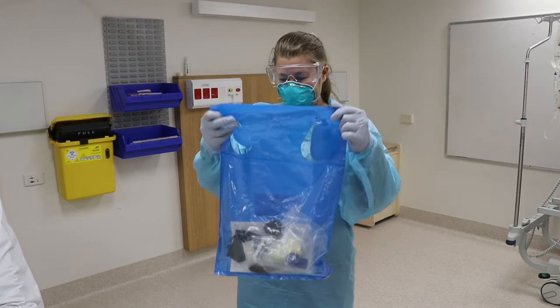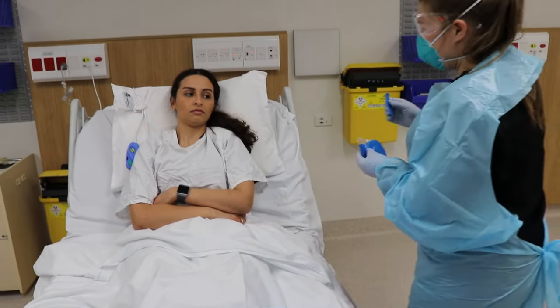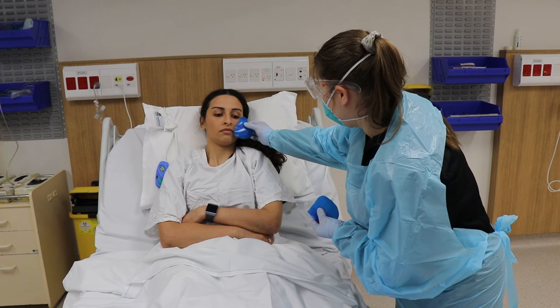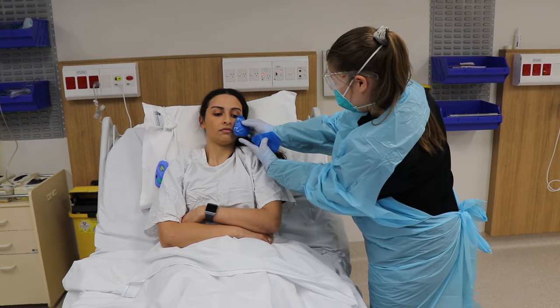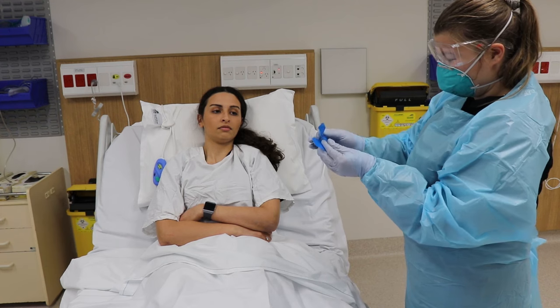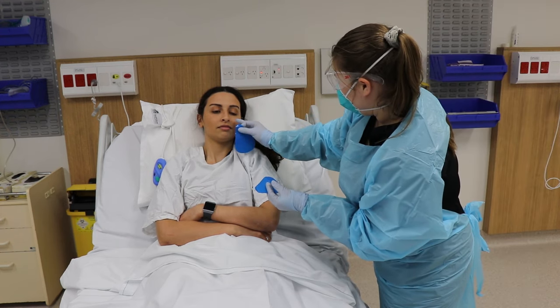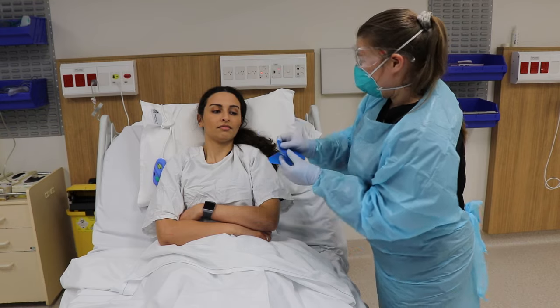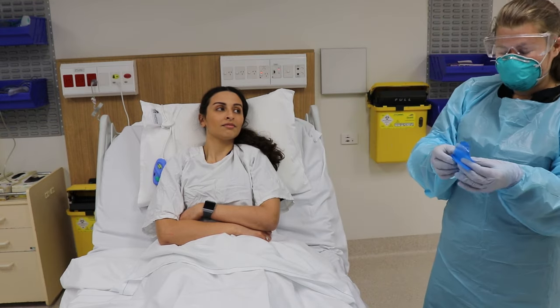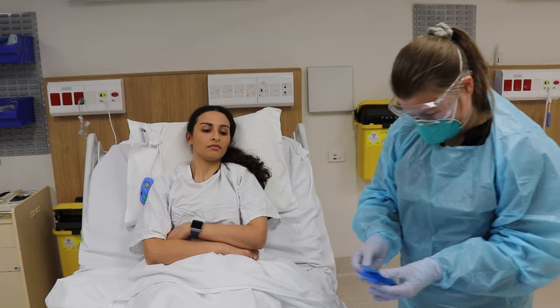Using the size guides, the bottom of the mask should fit under the lip, with the top covering the bridge of the nose. If the mask is too large, it starts to get into the eyes. Having a leak into the eyes is also an infection risk — it's going to be uncomfortable and prevent the patient from sleeping.